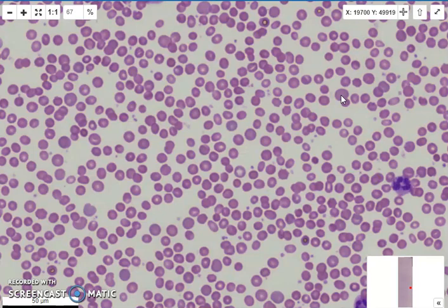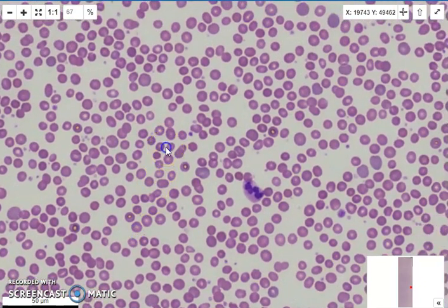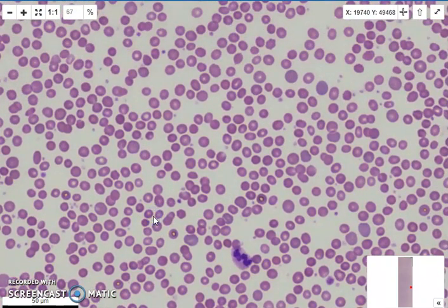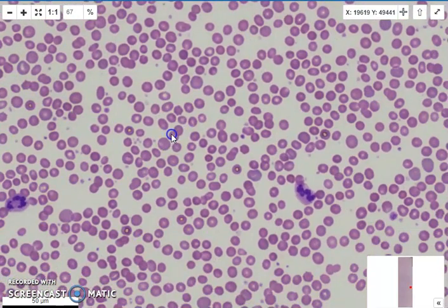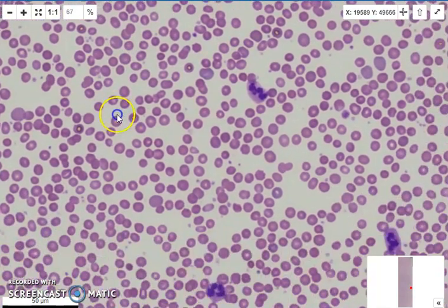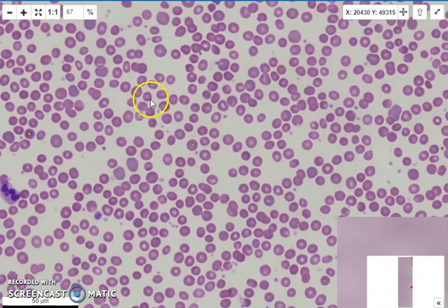So if I have increased reticulocytes, because my normal reticulocyte range is 1 to 4%, then I need to ask myself, why is my body giving me red cells before I need them? What's happening to my red cells? Where are they going? And because of that, I'm going to start looking for some of those clinically significant poikilocytes, such as your spherocytes, schistocytes, bite and blister cells, sickle cells. And so what I'm noticing when I'm looking through here is that I have a presence of spherocytes.